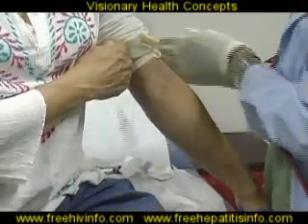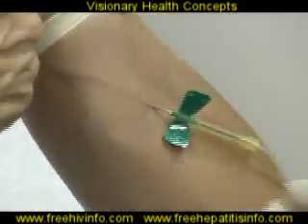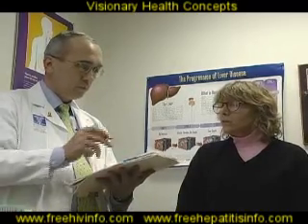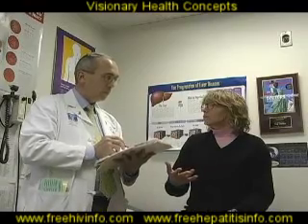The case study patient was accompanied to the hospital for the procedure by a reliable person who was committed to stay with her for an additional 24 hours. After ascertaining that there were no contraindications or conditions that might increase the risk associated with the procedure, Dr. Dietrich discussed the procedure once again with the patient and secured a signed, informed consent form. The patient changed into a hospital gown and was administered sedation and pain medication. The providers then confirmed the patient was comfortable and ready to begin the procedure. Dr. Dietrich will now describe the ultrasound and biopsy procedure in detail.